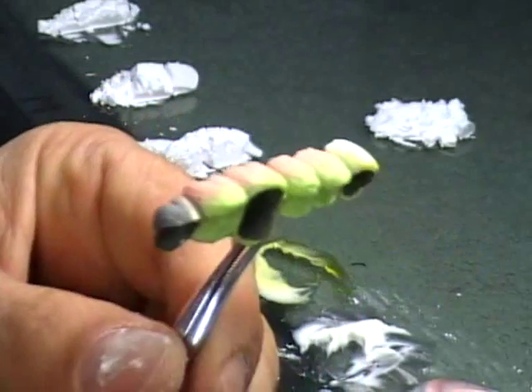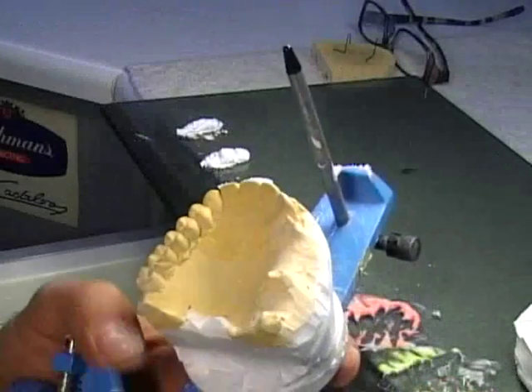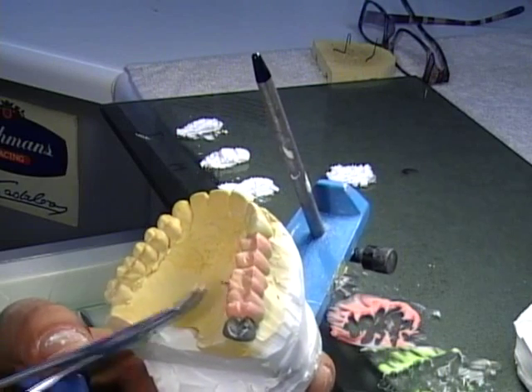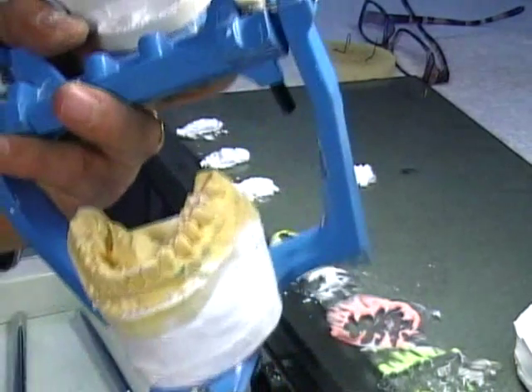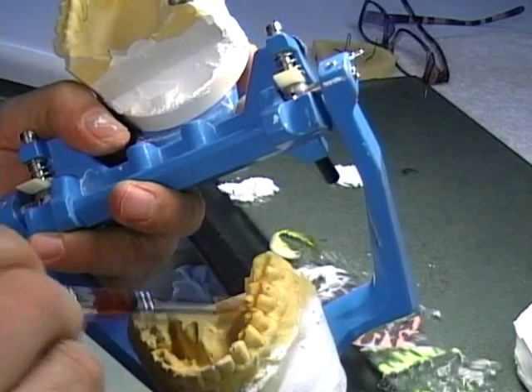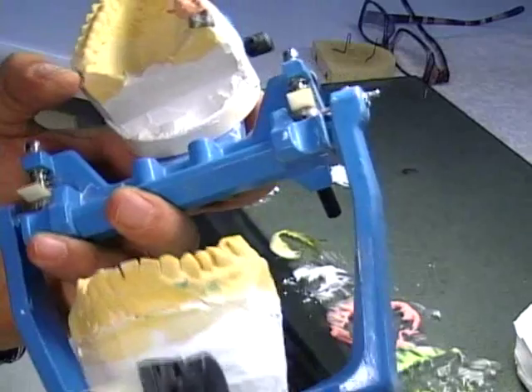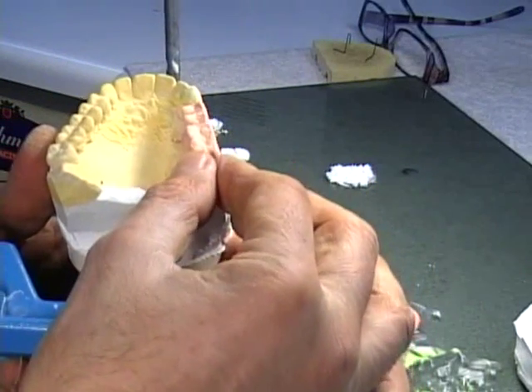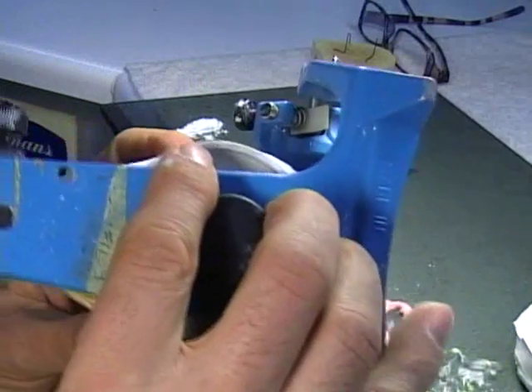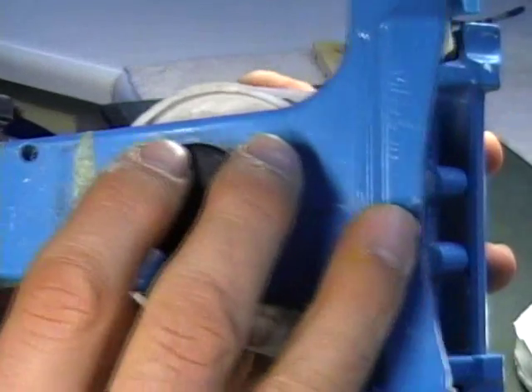Now let's put it on this model. We put it on the model — that's it. Make sure my model's wet and clean, that's it. And I want to bring my lower to my upper because this is kind of loose on here, but it's very good to have the right position, the right occlusion position. That's it, okay.